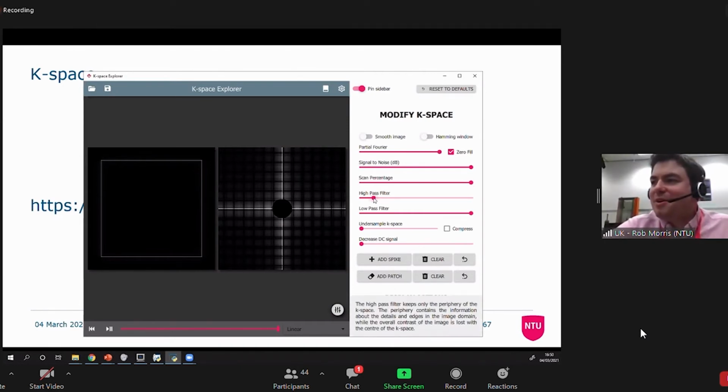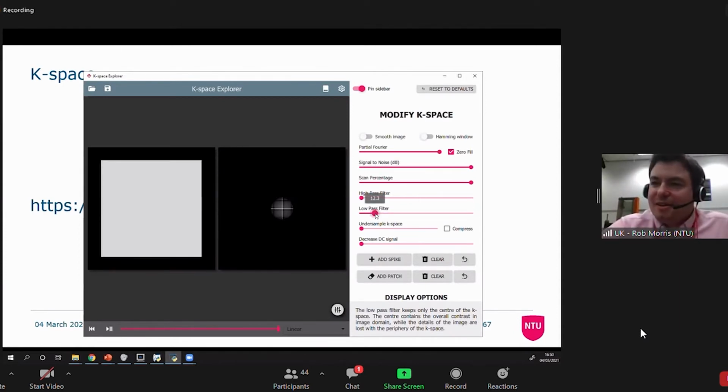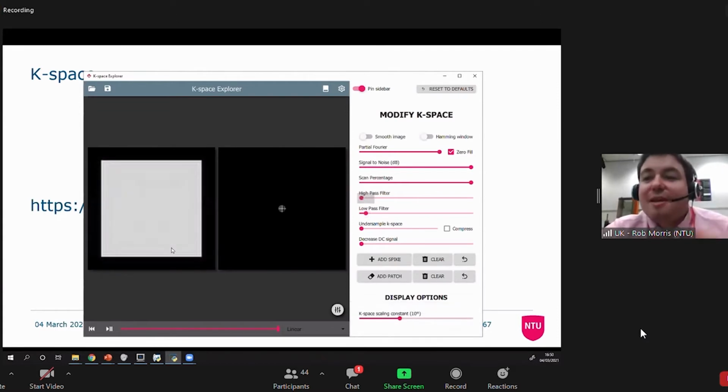If the program will let me swap these over now, and we just look at the inside, i.e. we trim out the edges, here it goes. Over time, the image should get more blurry until you take it too far. It will start to get blurry because we've not got those quick changes. What we have got still is our things which change quite slowly.